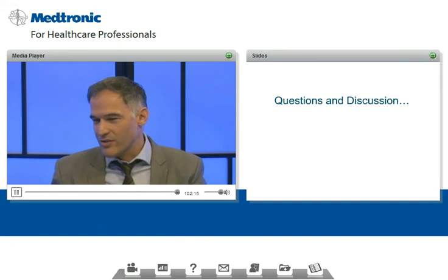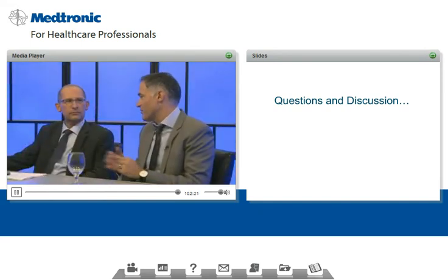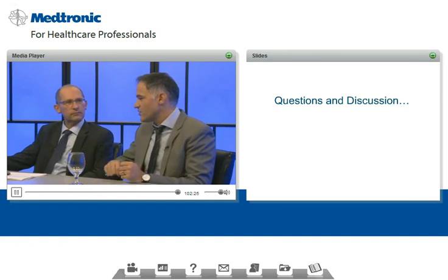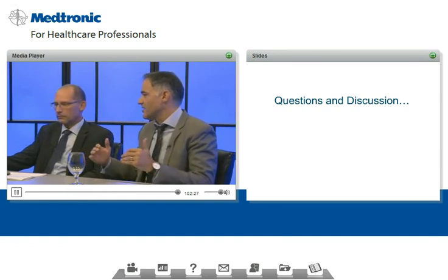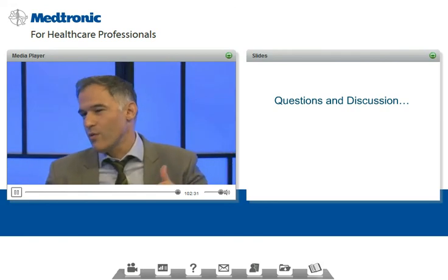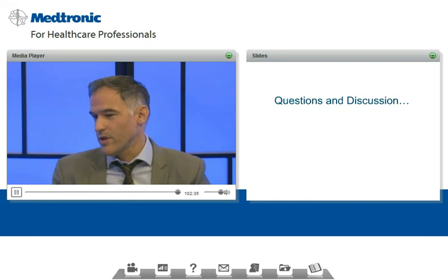So in my practice, just to get by, I like to keep some things constant, and so I like the active insulin time at 4 hours and just not make that the big controversy. But with the patient who's getting hypoglycemia, I might ease up on all of their parameters: extend the active insulin time, raise a target, raise a sensitivity, for example.